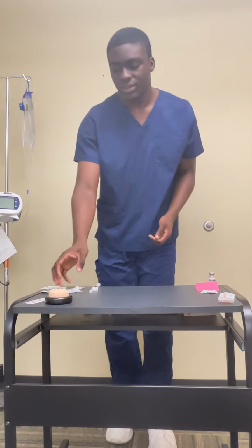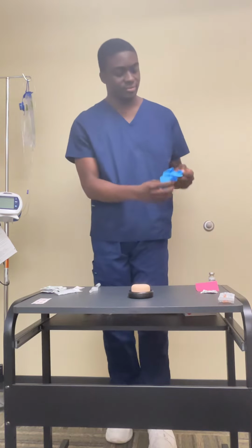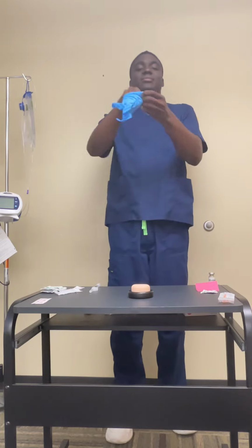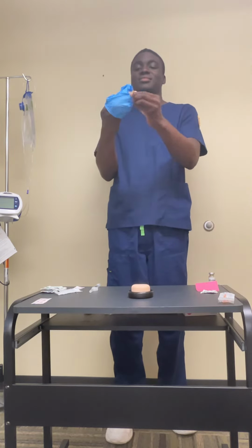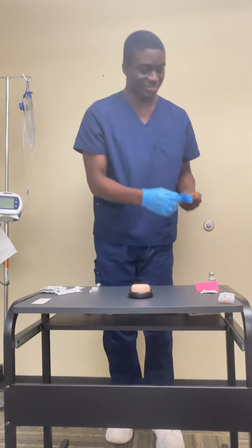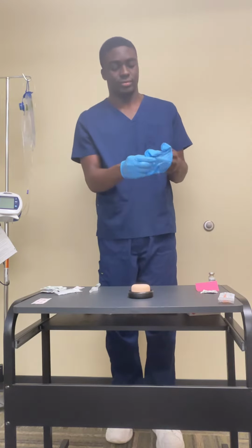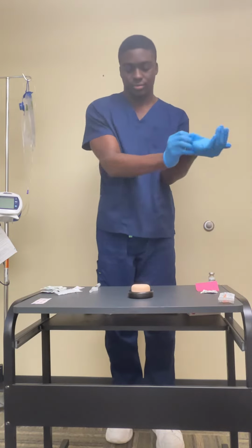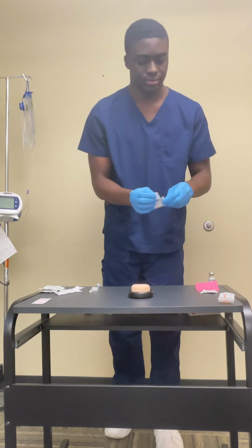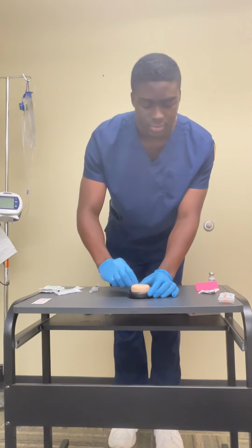And then I will prep my patient. I will put on my gloves, perform hand hygiene, put on my gloves. I will also ensure that I have the right dose, which is 1 milliliter, and at the right time. And since my site will be the right deltoid, I will wipe from the injection site and outward, wait for it to dry.